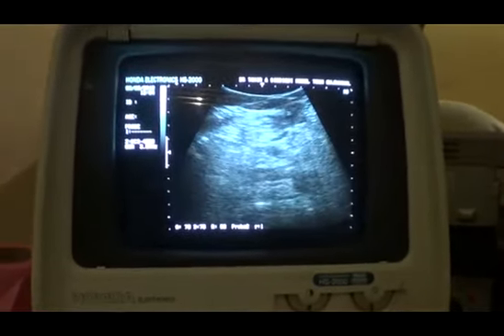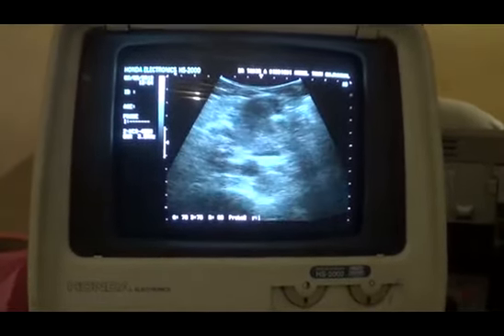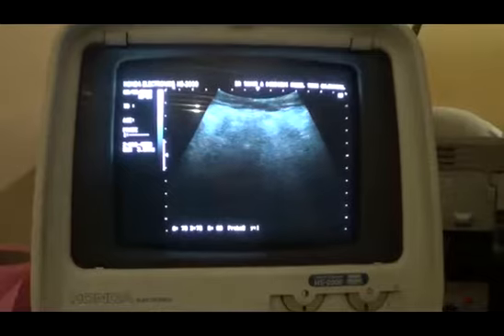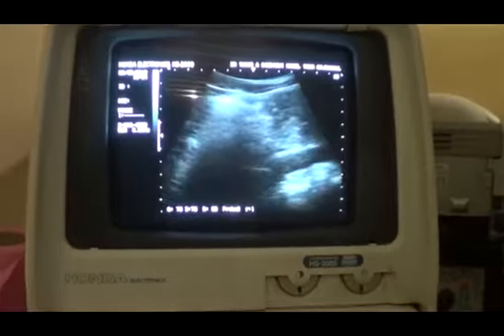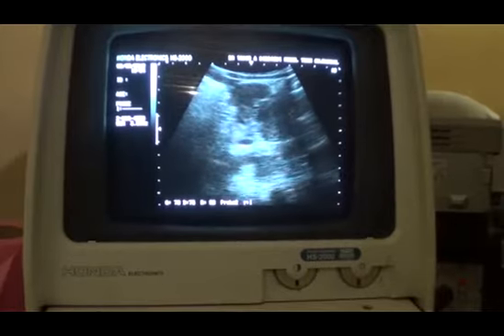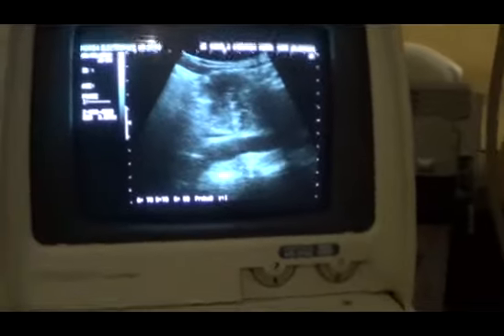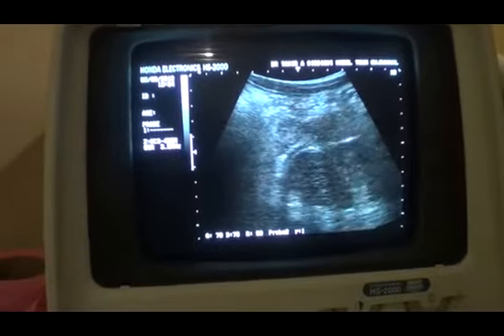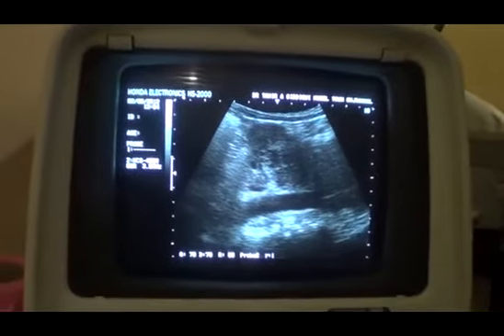Now I'm going towards the pancreas. As I move the probe towards the pancreas, in the epigastric region transversely, I see a large, solid, inhomogeneous mass anterior to the aorta, and there are not one, there are many, encircling the aorta on both sides.